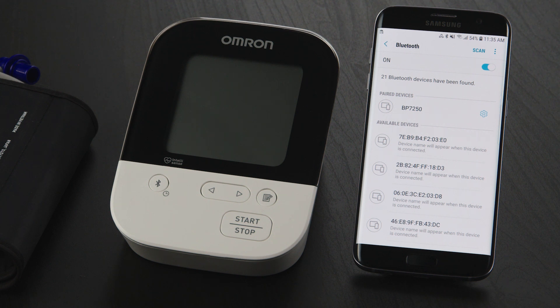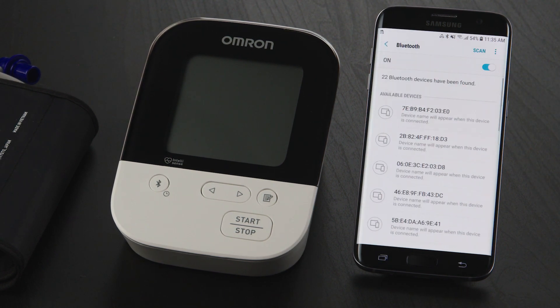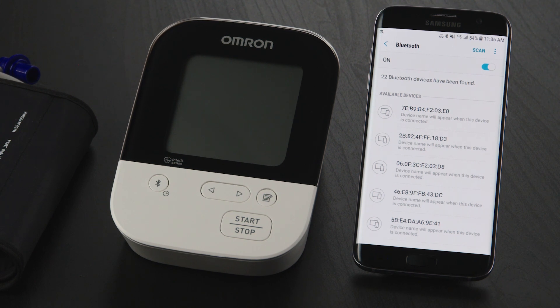If you do see those devices listed, tap on the Settings icon to the right of the device. Then tap on the Unpair button to remove the device. Follow the same steps to unpair any other Omron devices.